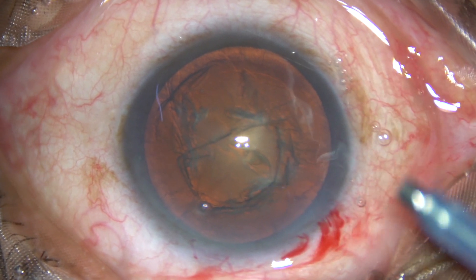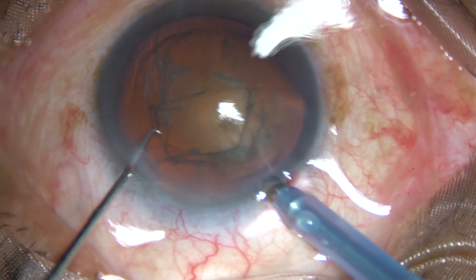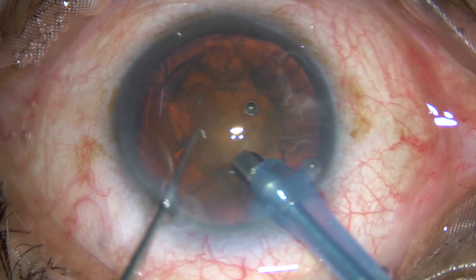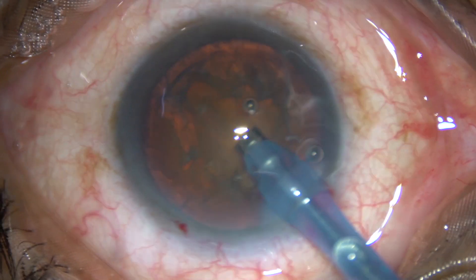The tip of the phaco handpiece is introduced into the anterior chamber, beveled down. At this time, some superficial cortical matter is aspirated to improve visibility.